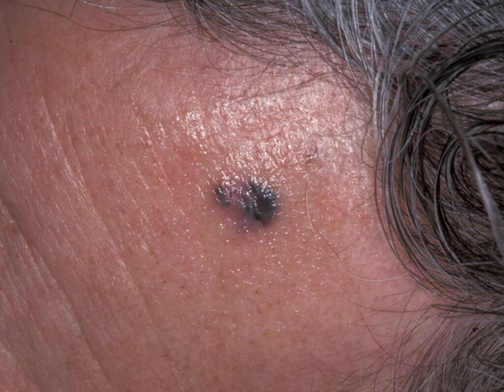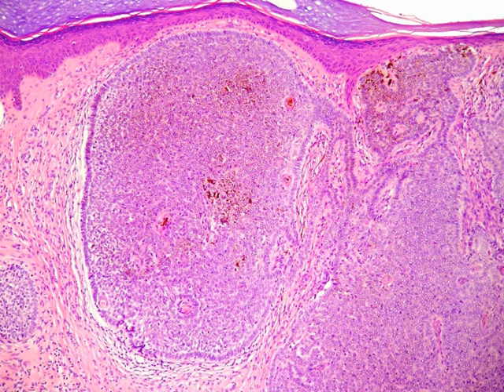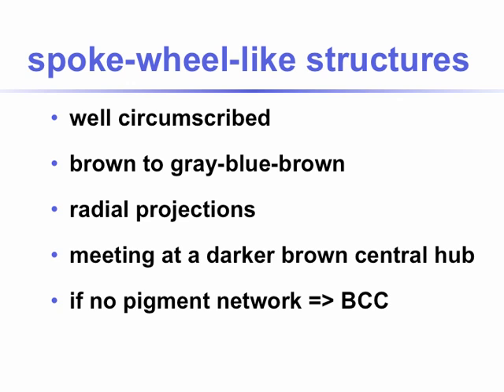Basal cell carcinoma on the forehead, clinically. Dermoscopically, we see in the right lower part a large, well-demarcated, blue-gray ovoid nest, no pigment network, no argument for a melanocytic lesion. This is very suggestive for a pigmented basal cell carcinoma. Here, the histopathological correlation showing very big and large pigmented tumor nests, corresponding to what we've seen before.